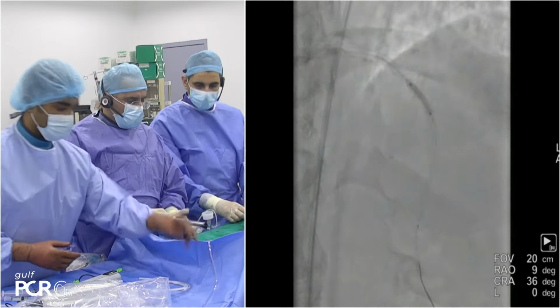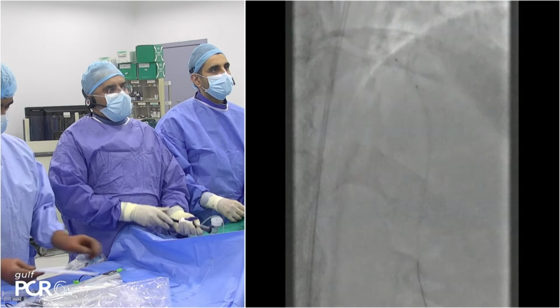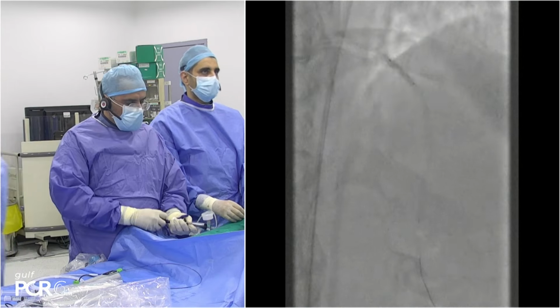What is this balloon? You have already ballooned it to the 3.0, right? This is a different balloon? No, that's the proximal part. Now we're going to the distal part of the stent, going with 2.5. Just make sure that we are optimizing the distal part.